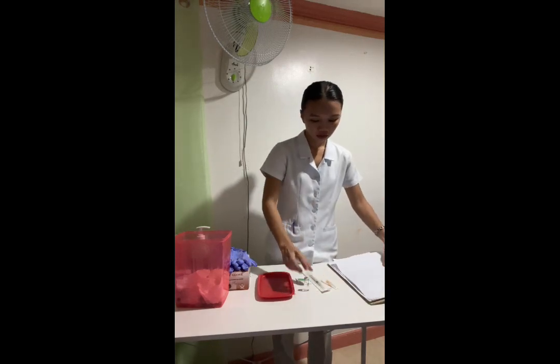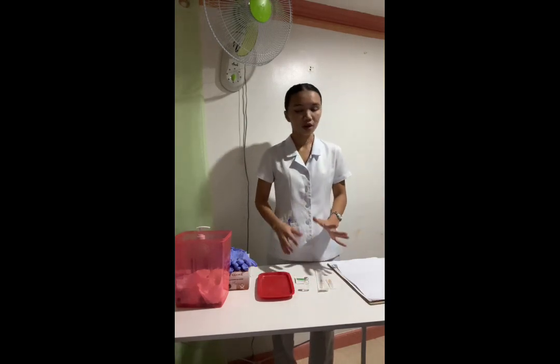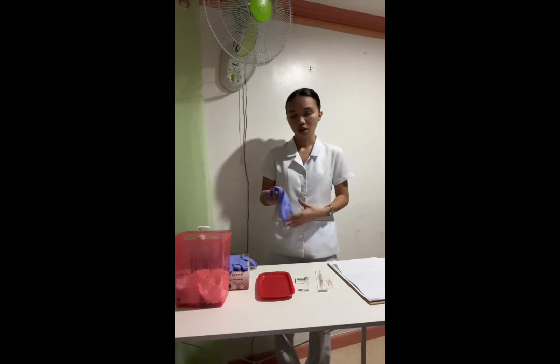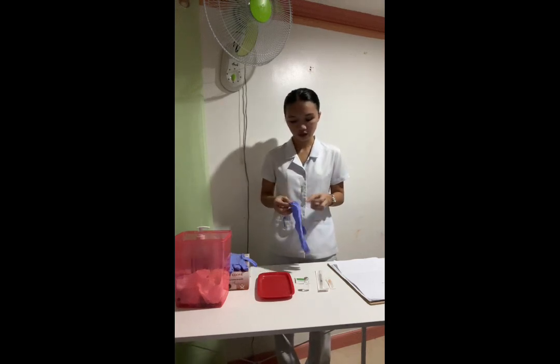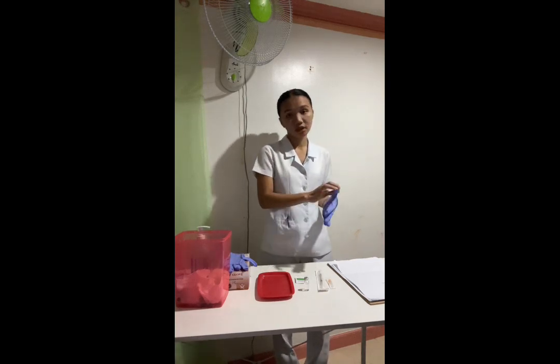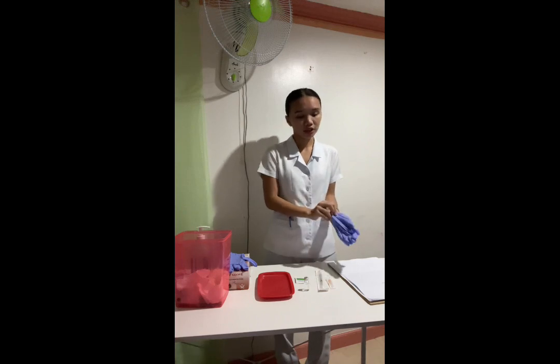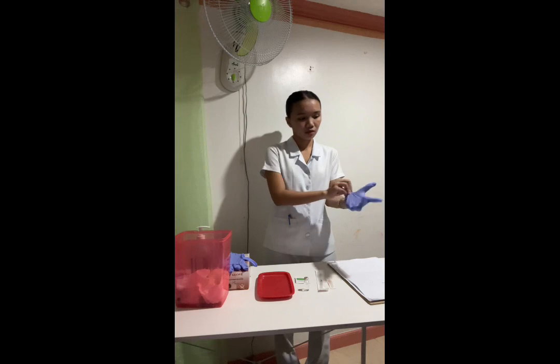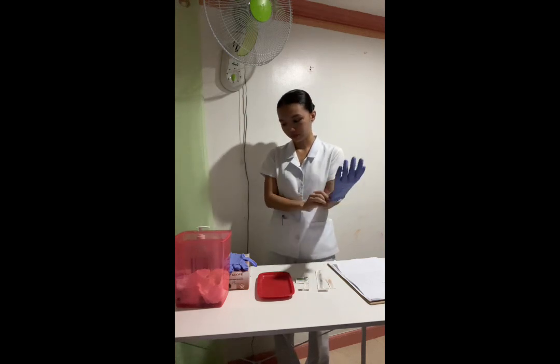Okay. So now, in preparing the medication in vial, we are going to perform hand hygiene and also observe any other appropriate infection prevention to deter the spread of microorganisms, and also we have to use gloves to protect ourselves from any cross-contamination. And since I had already done my hand washing earlier before going here, and also hand hygiene, I can now wear my clean gloves.